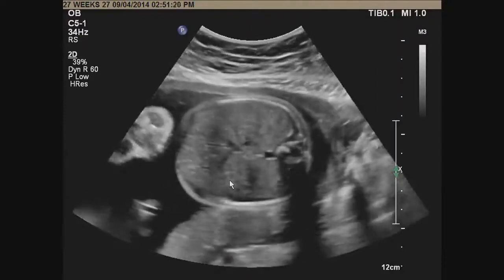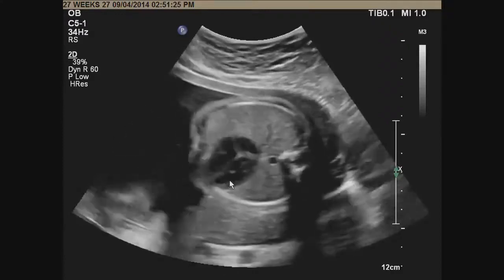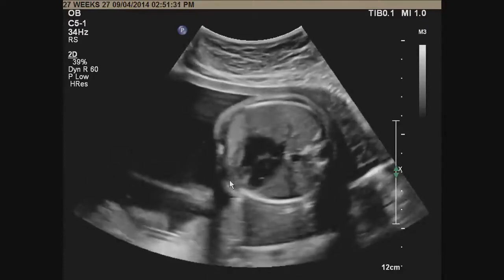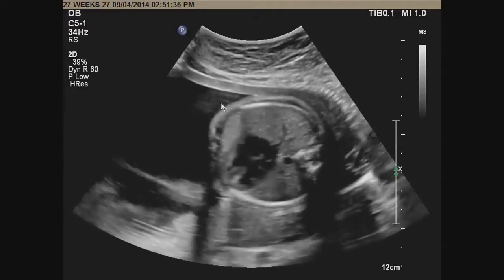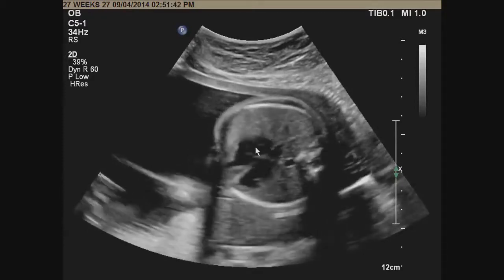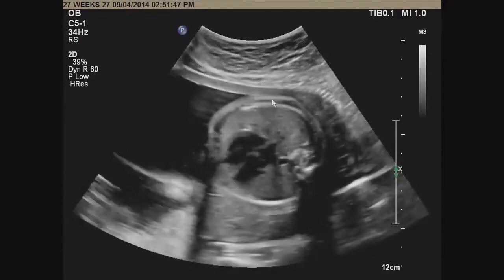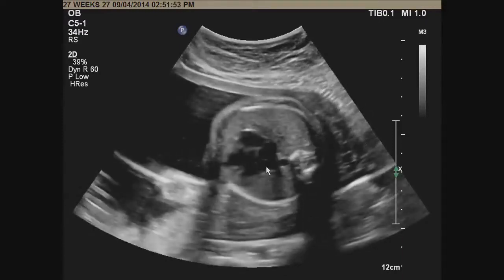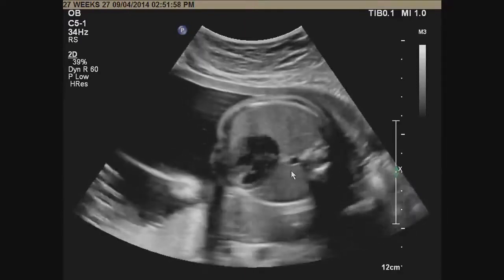Then I'm going to slide back up into the chest. Given that the left side is down, I'm going to work a little bit to improve my image. You see how I'm coming into the heart through the ribs. I'm going to try to image the heart with the ultrasound beam coming away from the ribs to minimize shadowing, but also to help me get to an axial view of the heart. This is what we call a basal view, or coming from the base of the heart. It's good to look at the pulmonary veins, so you can see them here even on grayscale. This is left atrium, right atrium, left ventricle, right ventricle, descending aorta, right?